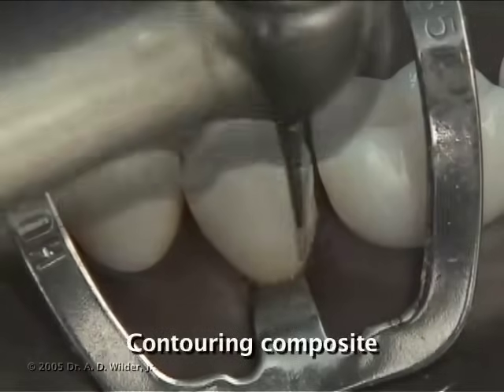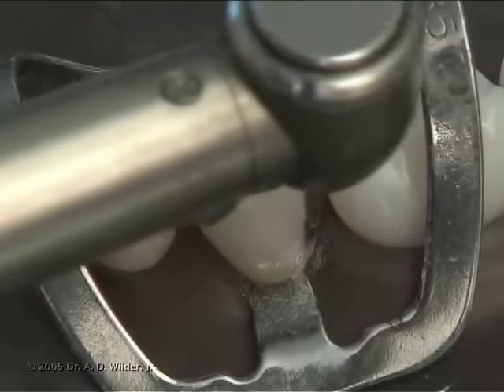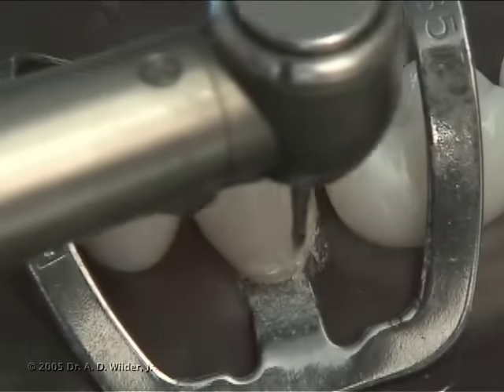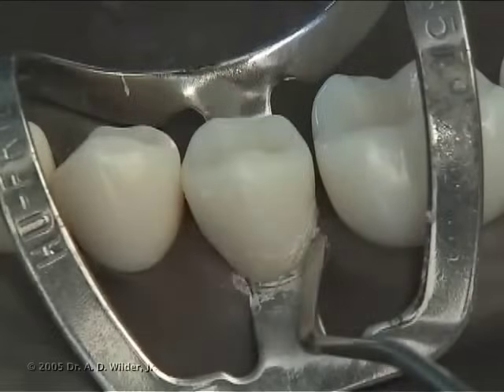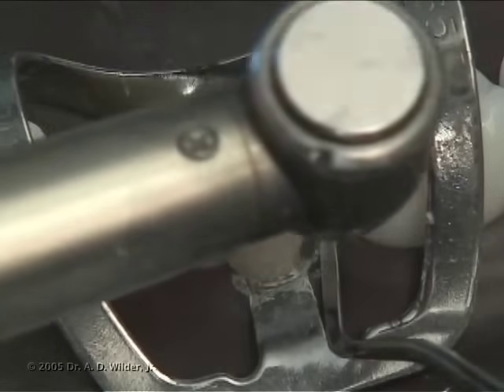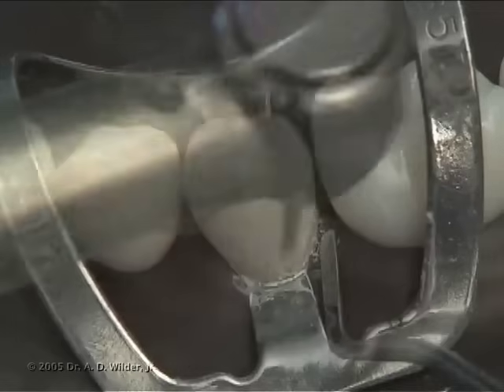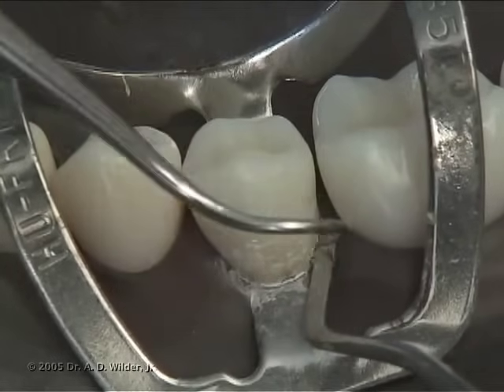You can contour the composite further with a flame-shaped finishing burr to recreate the natural anatomy of the tooth. Use light strokes as needed while maintaining contact with both composite and natural tooth structure to avoid inadvertently gouging the material. You may need to hold the rubber dam or soft tissue out of the way when performing this step.